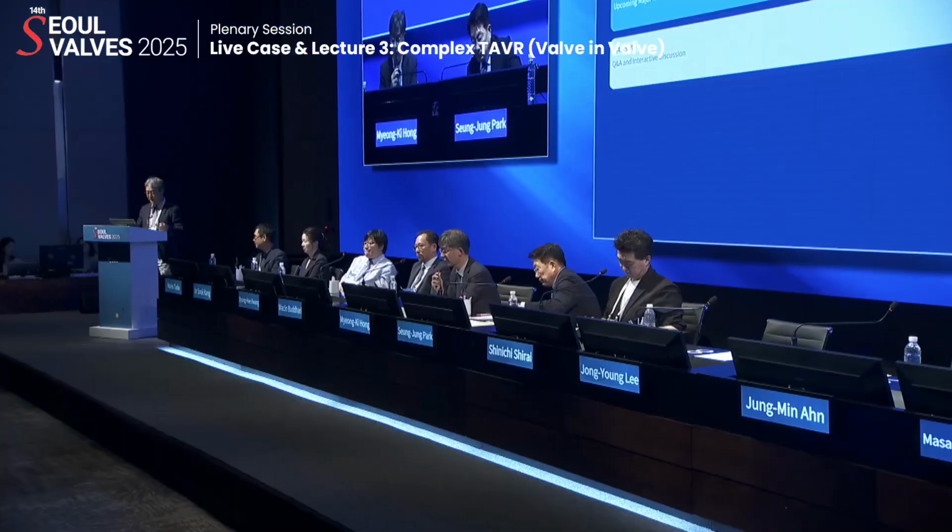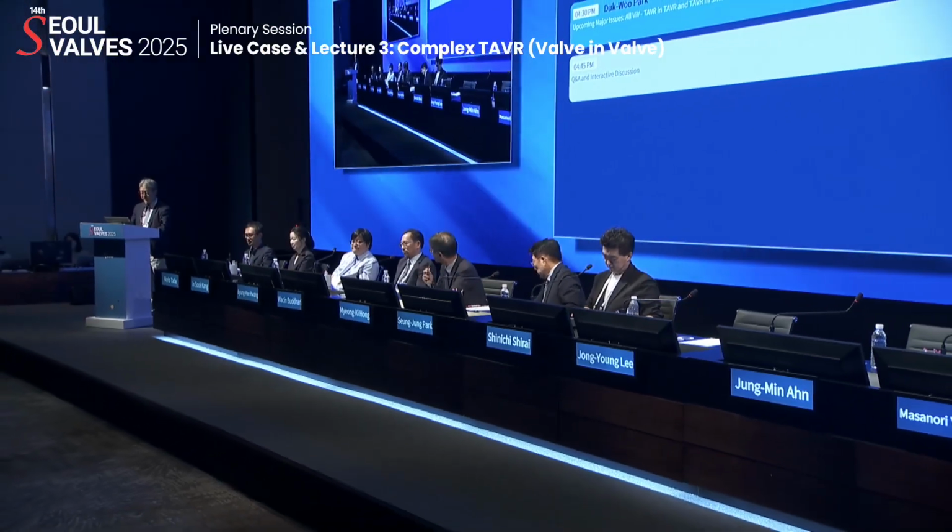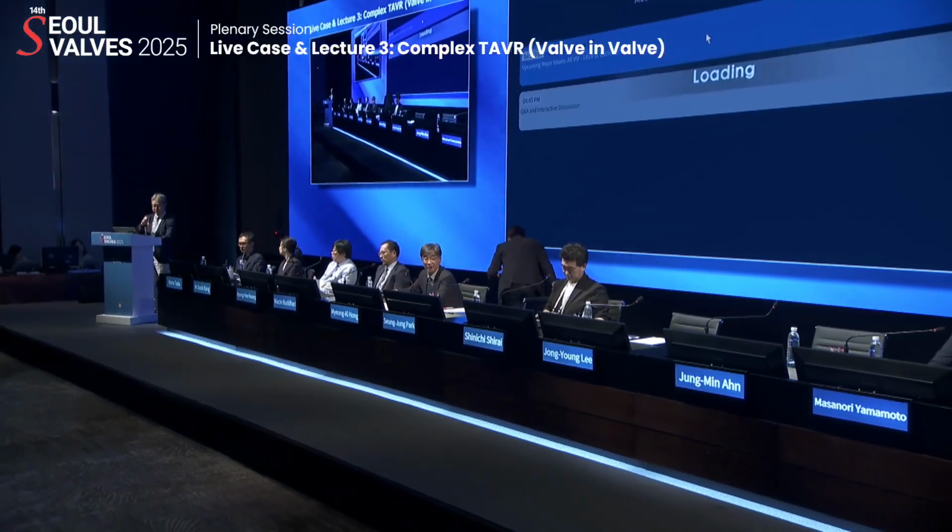We will change to the lecture first and then return to the live cases. The lecture is on the upcoming major issues: valve-in-valve, TAVR in TAVR, and TAVR in SAVR. TW, please. Okay, thank you.